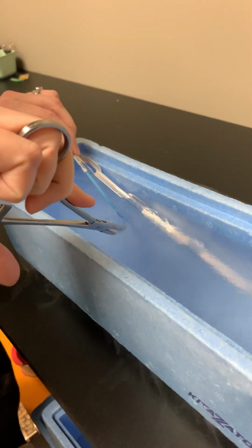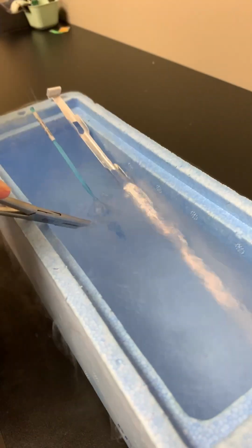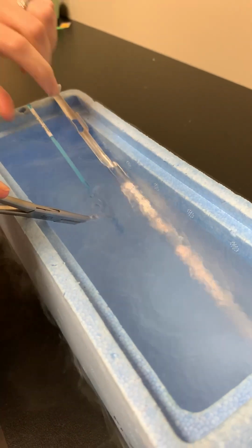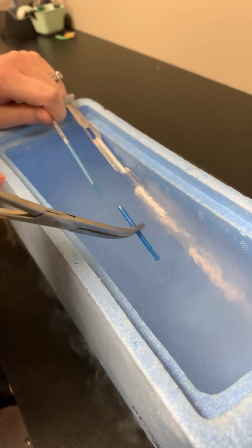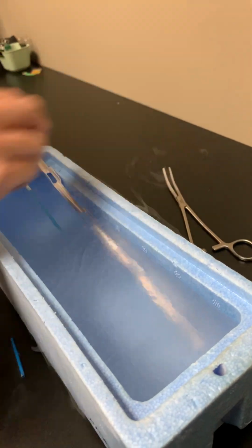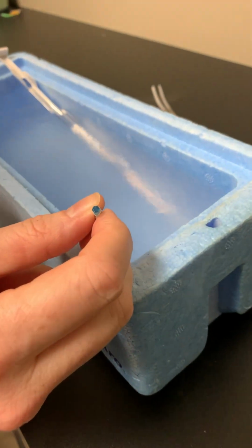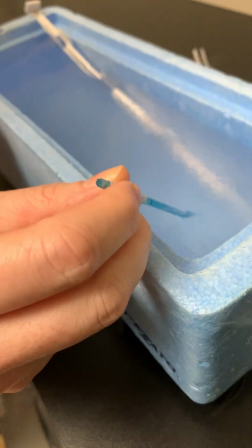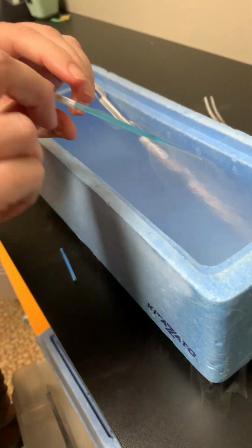So what we would come in here and do is we'd come in with some forceps. You can watch it bubble against me. If I stuck my hand in this, it's instant frostbite. It could be very dangerous because it's so cold. So you uncap it underneath the liquid nitrogen, take the cap off. And at this point, I would take out the device and I would plunge it straight into a dish that had media in it. So this is the device the embryos are on. So I'm going to pull it out.